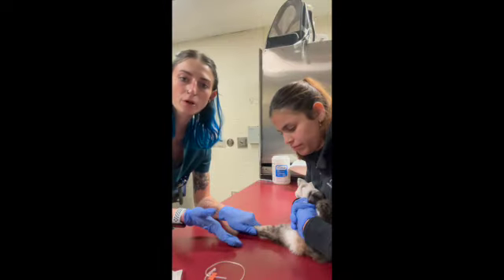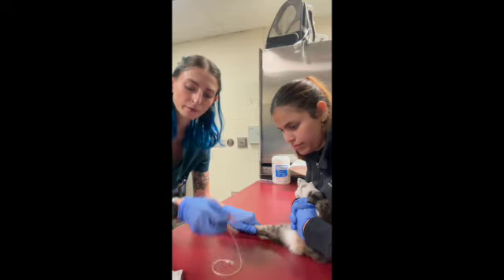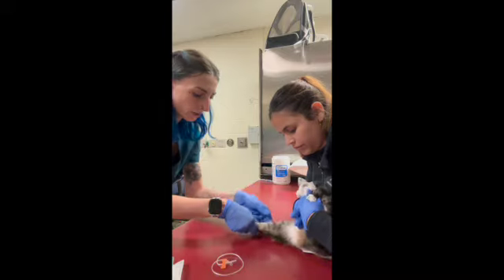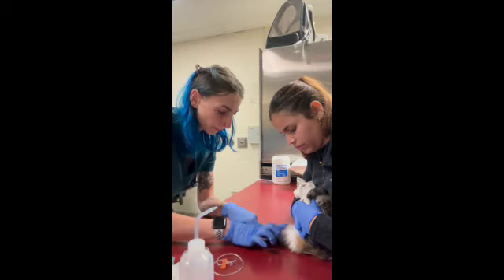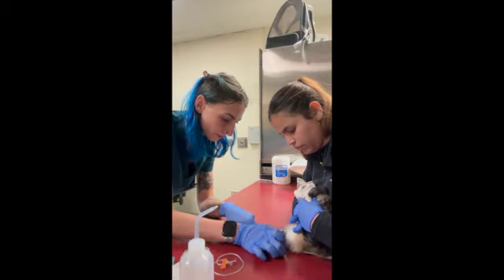Medial saphenous blood draw on a feline patient. I just have a band-aid here, a 24 gauge butterfly, a 1 ml syringe, and then just some isopropyl alcohol. We already have our coworker here restraining for a medial saphenous, and so I'm just going to apply my alcohol. And then I typically just like to part the hairs so that I can better visualize her vessel.